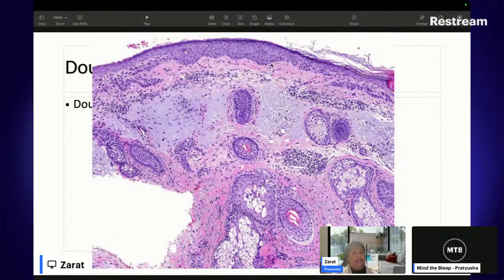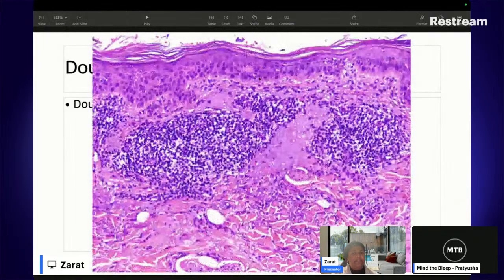And we have an abnormality in the epidermis. Now, which cells are affected? So again, if you look at the cells close up, these are the cells with the pink cytoplasm, no clearing. So we know that these are keratinocytes. So we have a problem with the keratinocytes in the basal layer of the epidermis, and there is associated sun damage.